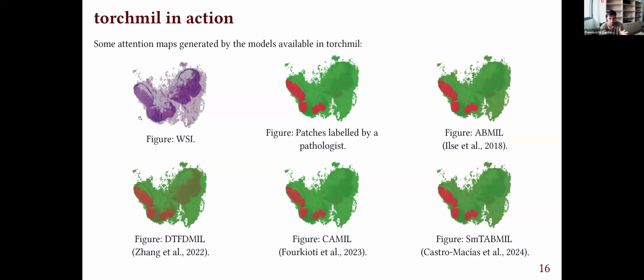And I just wanted to show you what things you can do with torchmil. These are all models that are available in torchmil, and essentially you can train them and you can obtain predictions with them.